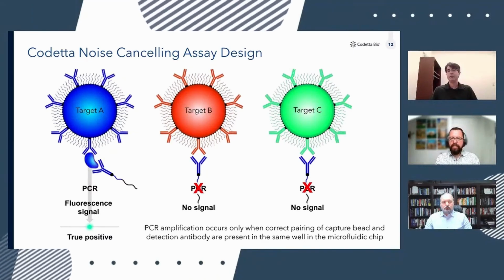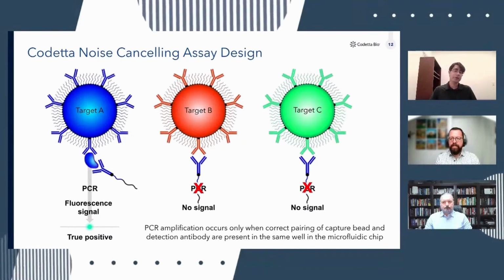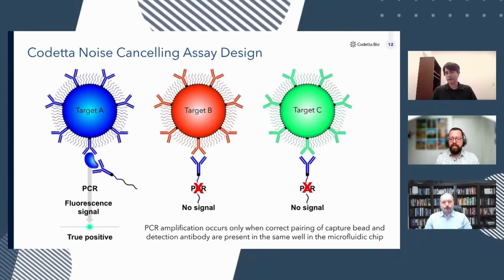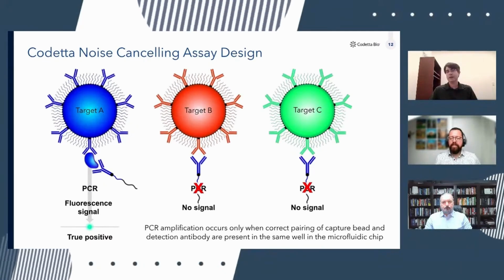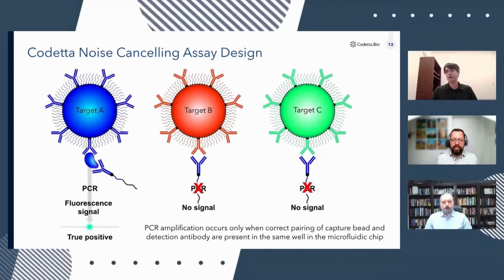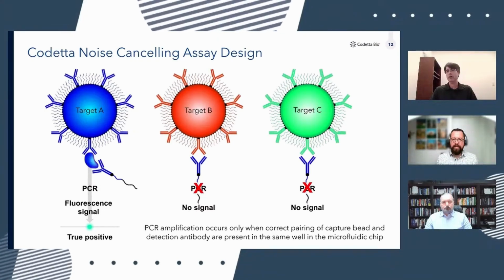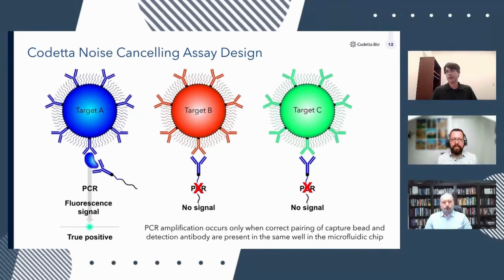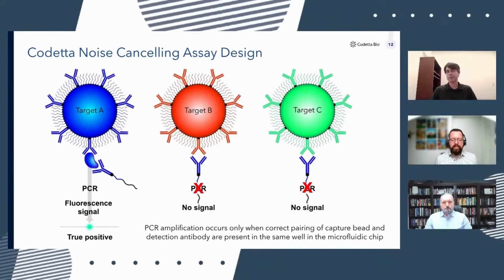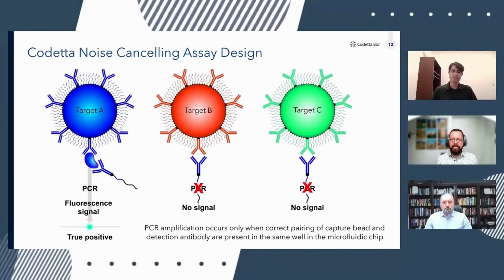But with multiplex assays, especially as you increase the number of plexes or number of targets per sample, there's opportunity for nonspecific interaction between antibody pairs. And that's illustrated with the red and green beads here, where if there's some low level of nonspecific interaction between a detection antibody for a different target, while that still may occur, there's no opportunity for PCR amplification because you don't have the correct pairing of forward primer to DNA tag present in the nanowells or microwells of the microfluidic chip array. Again, because there's only a single bead per well, there's only a single plex PCR reaction that can occur in each well. So any type of nonspecific interaction that occurs does not result in any PCR signal.